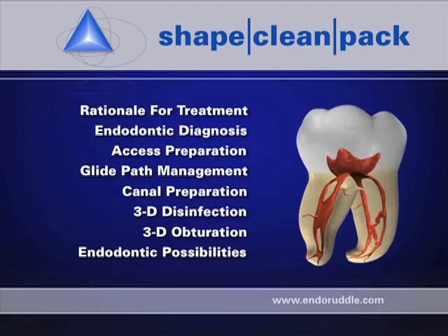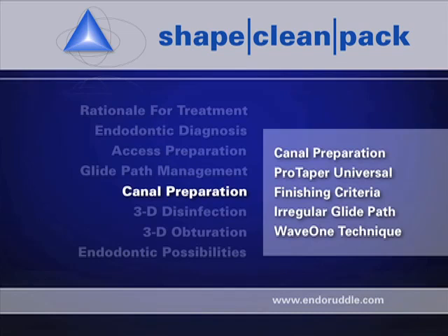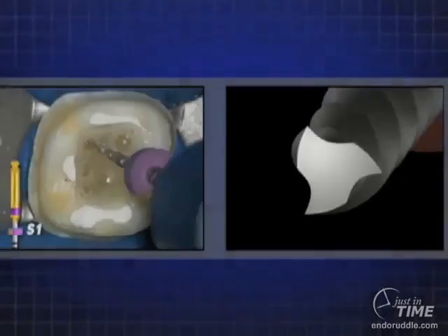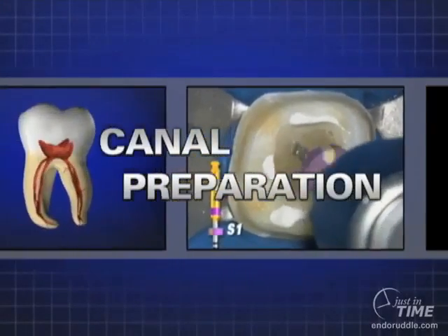And certainly when we think about canal preparation, we think of a lot of different things that mean something different to each one of us. But certainly the instruments we use to create the shapes in these various routes are critical and will in some extent dictate final results. Today I'm going to talk about specifically ProTaper Universal, and of course we can reciprocate instruments, we can spin instruments, and these critical distinctions will be covered later in the show.